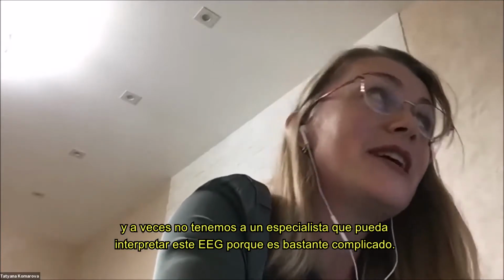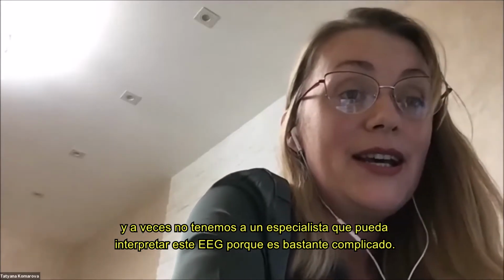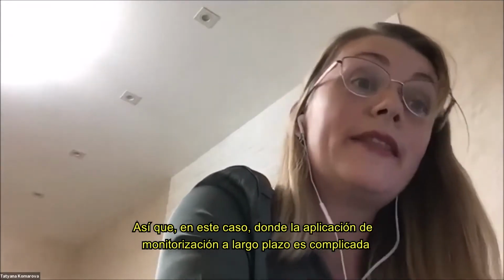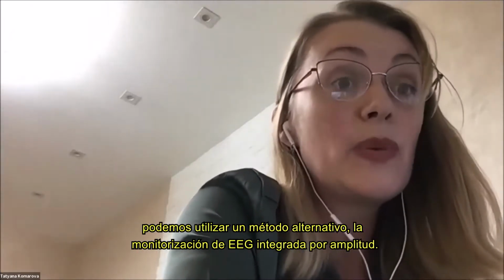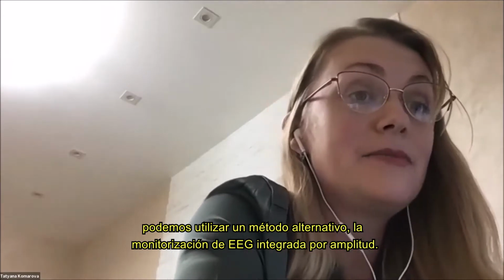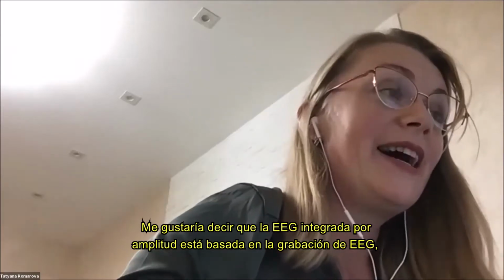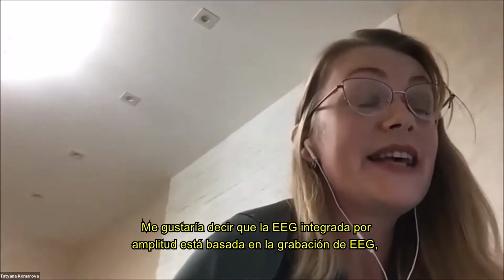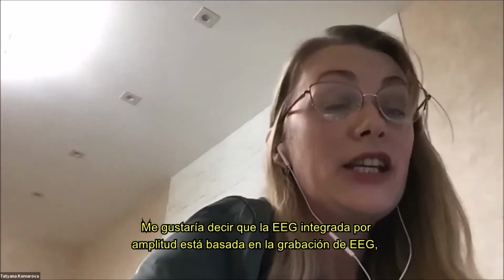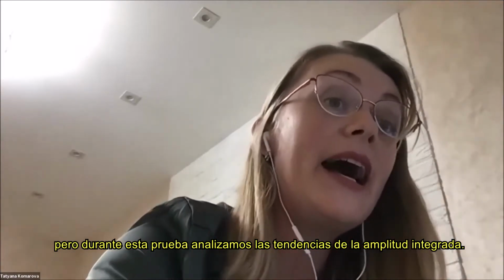And sometimes we don't have a specialist who can interpret the EEG, because it's rather complicated. So in this case, the application of long-term monitoring is limited. We can use an alternative method, which is the monitoring of amplitude integrated EEG. Amplitude integrated EEG is based on EEG recording, but during this test we analyze amplitude integrated trends.